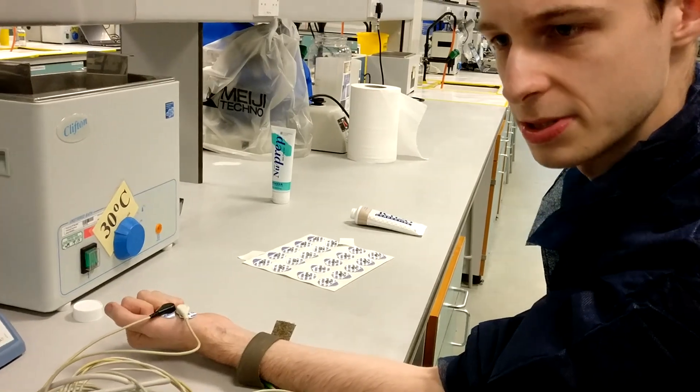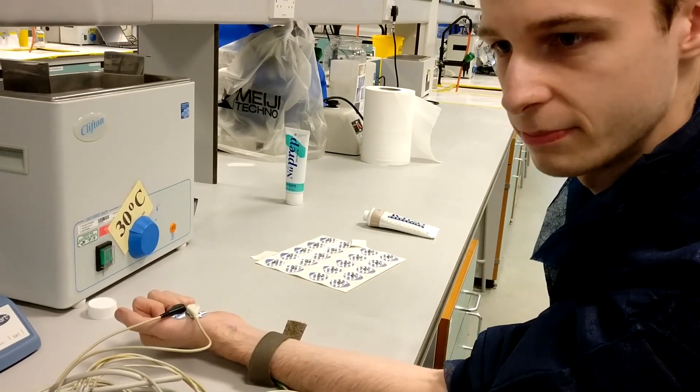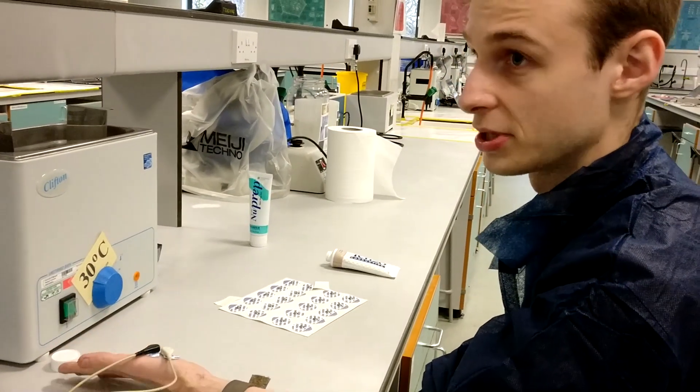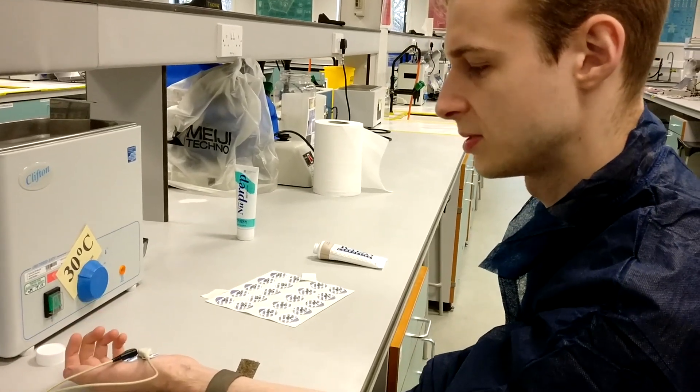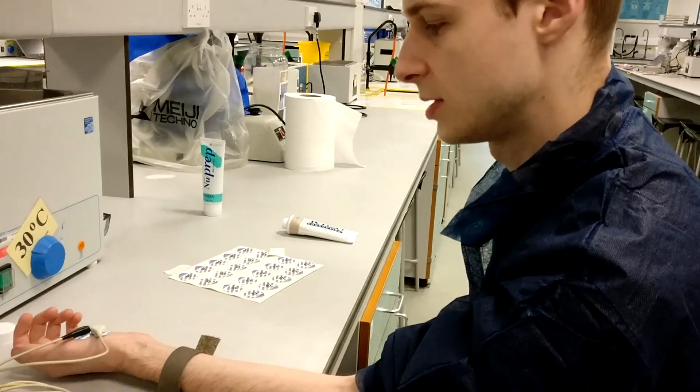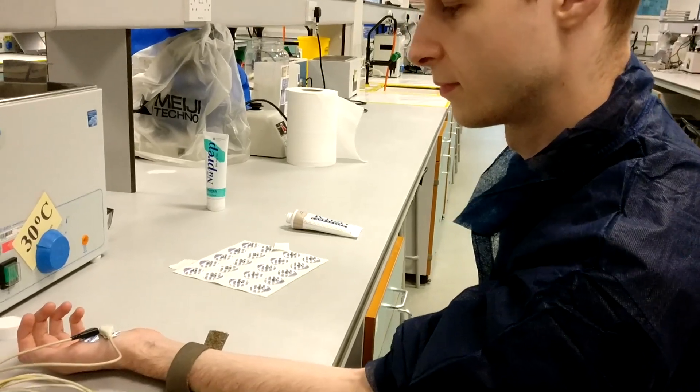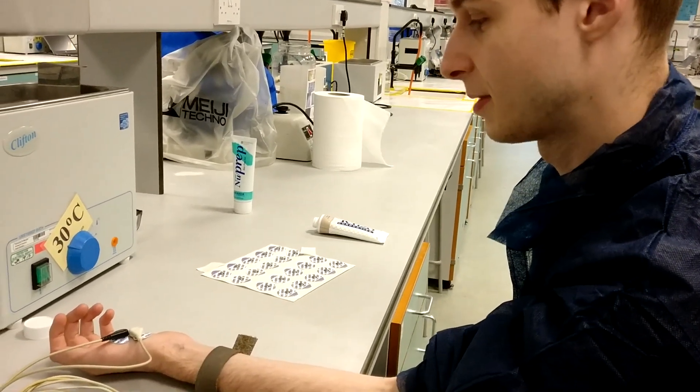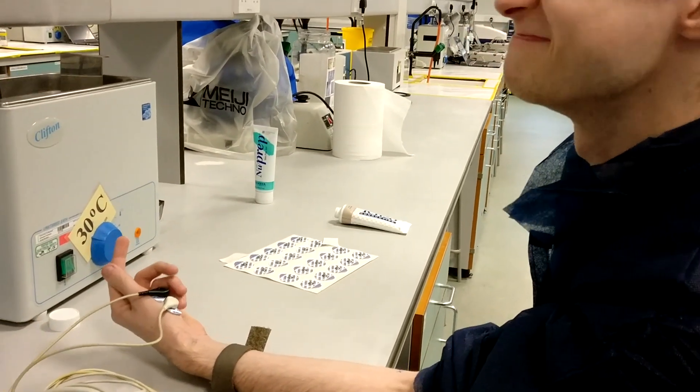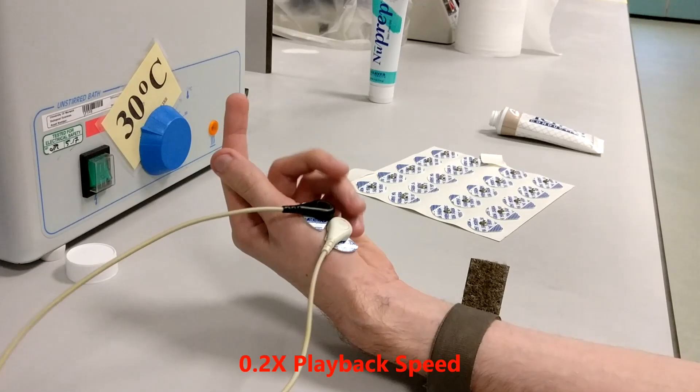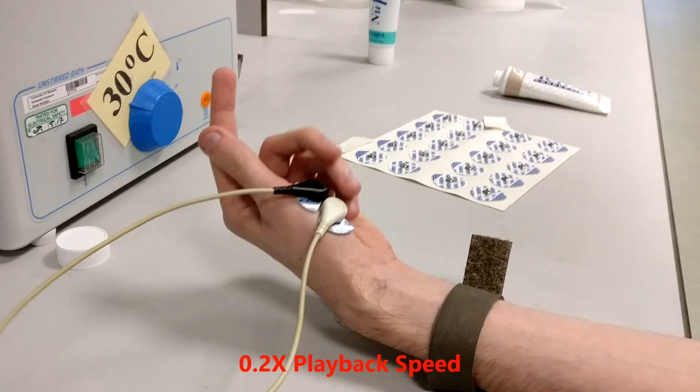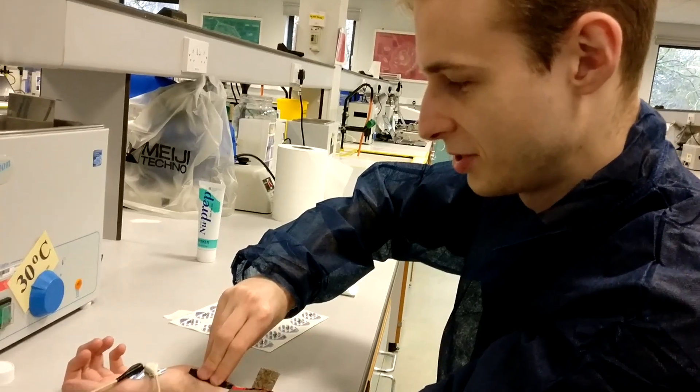This time, it's the same frequency, but we've upped the pulse width, so it should be a longer, discrete stimulation pulse. See what happens. My muscles are apparently getting—oh—going to ache tomorrow.